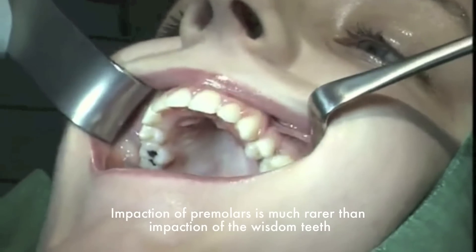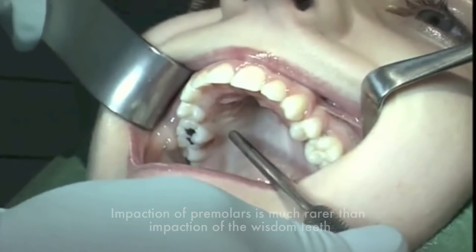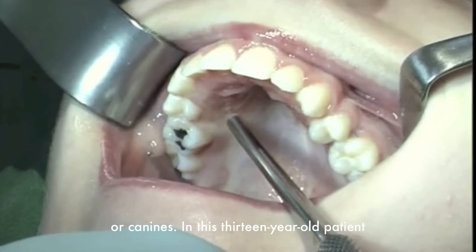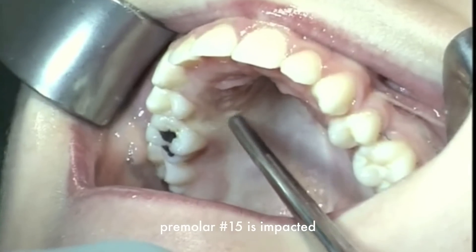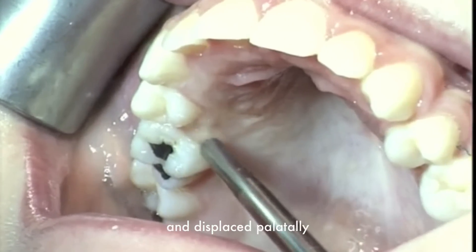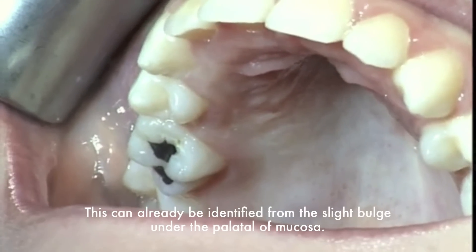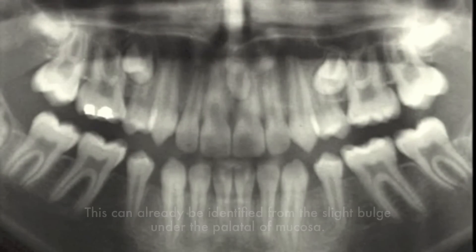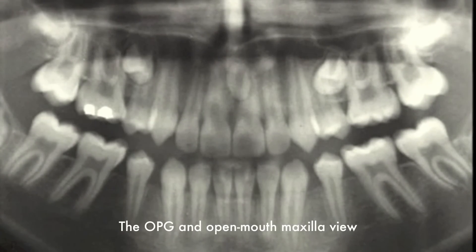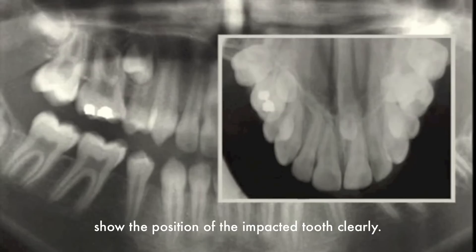Impaction of premolars is much rarer than impaction of the wisdom teeth or canines. In this 13-year-old patient, premolar 1-5 is impacted and displaced palatally. It can already be identified from the slight bulge under the palatal mucosa. The OPG and open mouth maxilla view show the position of the impacted tooth clearly.